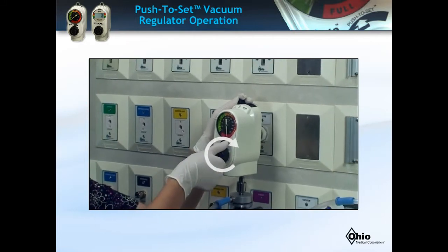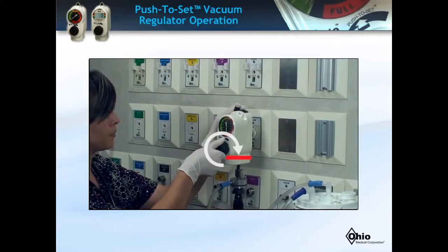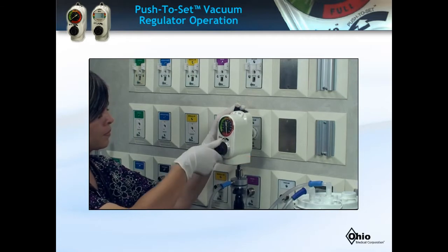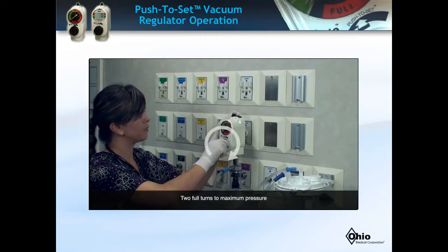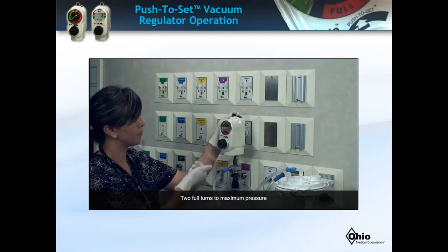Take caution not to over-rotate the knob. Once you feel resistance while pushing and turning the knob, this indicates the device is at maximum pressure. Forcefully turning the knob will damage the regulator. In an emergent situation where clearing the airway quickly is critical, the PTS adult regulator requires only two full turns from zero to reach maximum vacuum pressure.